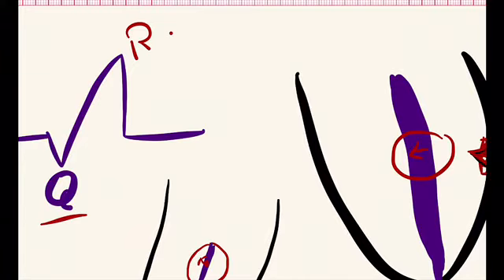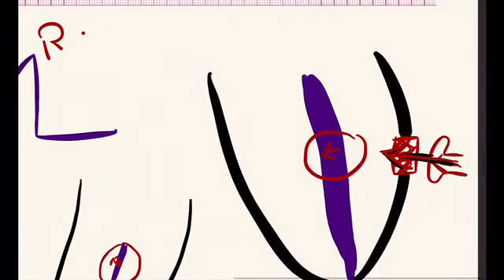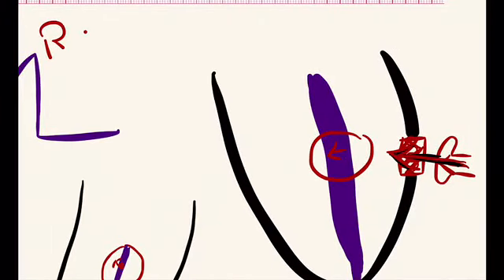Okay, and this Q wave has a certain height, and it is very short normally, but because there is death of this tissue here, we can directly see the septum from this electrically neutral window.